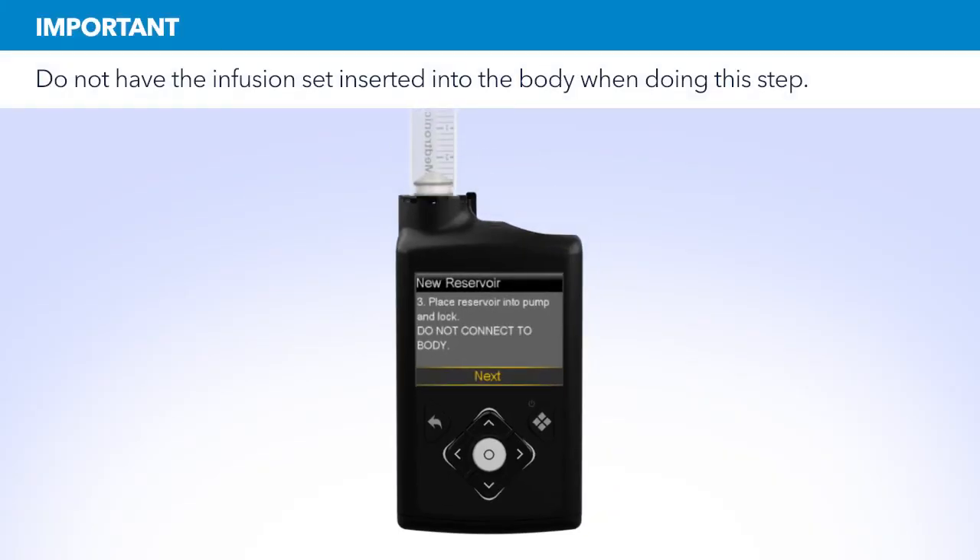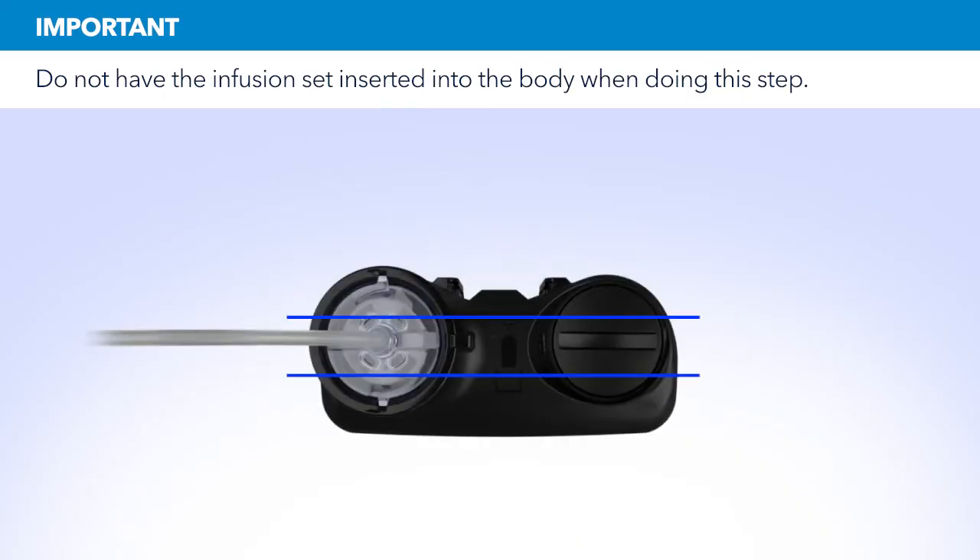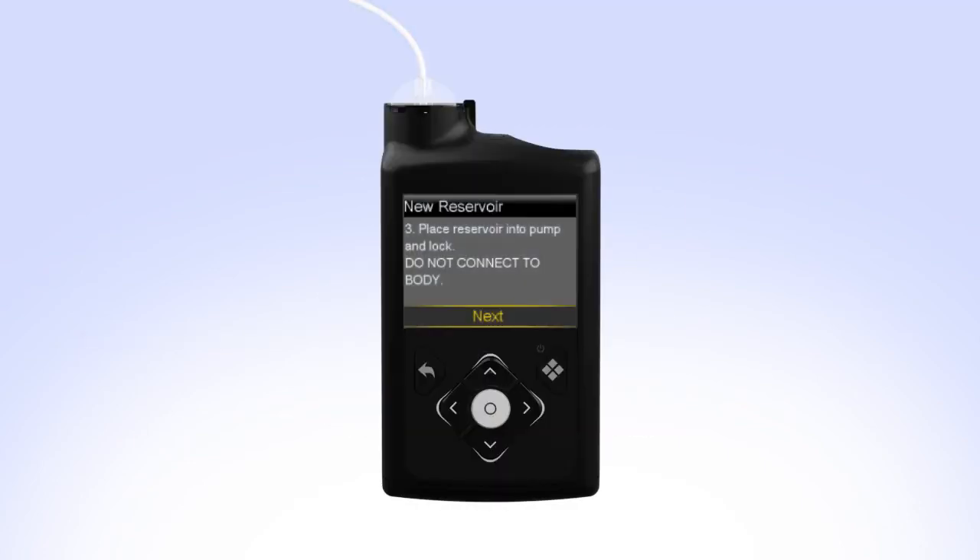Put the reservoir in the pump and turn the tubing connector clockwise until you feel the reservoir lock into place. The tubing connector should line up with the groove in the battery cap of your pump. On your pump, select Next to go to the load reservoir screen. With Load highlighted, press and keep holding Select until the screen shows Complete. When you see Complete, do not connect to body, and a yellow check mark on the screen — select Next.